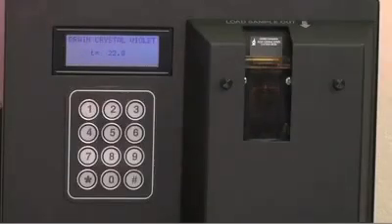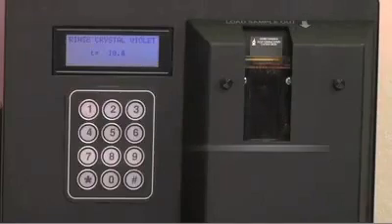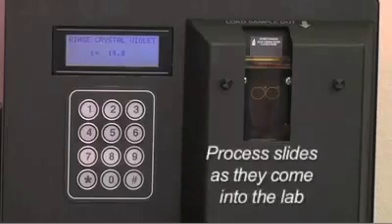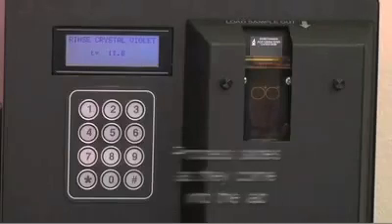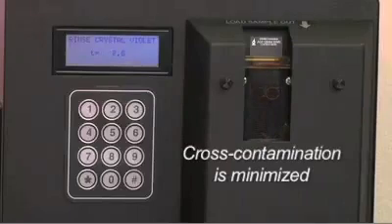Depending on which Gram cycle you picked, walk away from the instrument, view other slides, or run other tests. No more waiting to collect slides to rack up and flood. Instead, process slides as they come into the lab. With the properly prepared slide, cross-contamination is minimized.